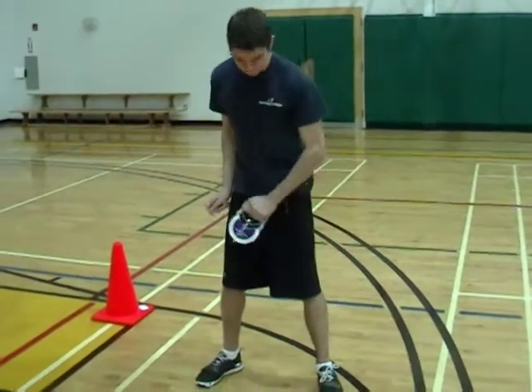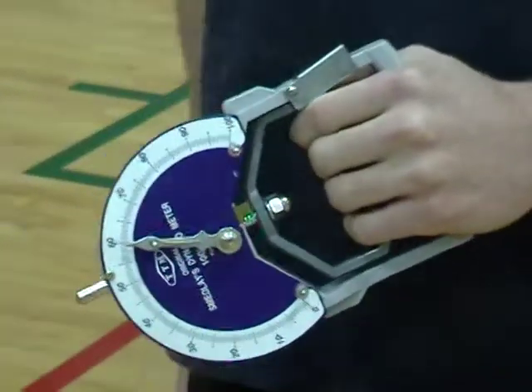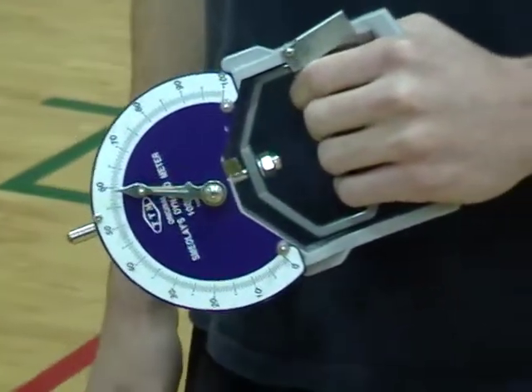Perfect for the males is 120 combined with the left and the right. Perfect for the females is 74 combined with the left and the right. Hand dynamometer test.